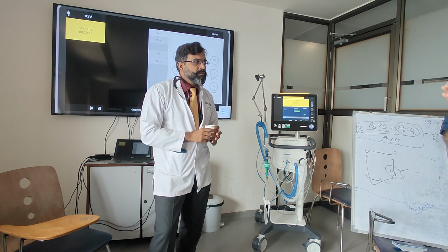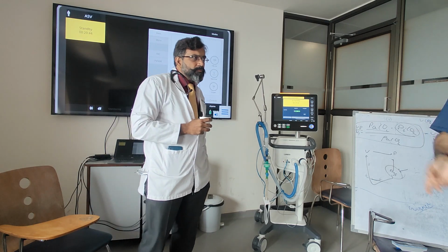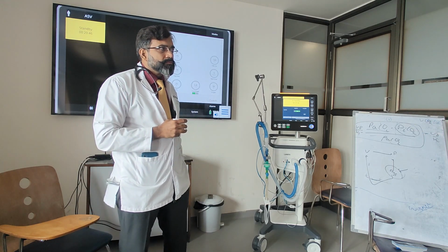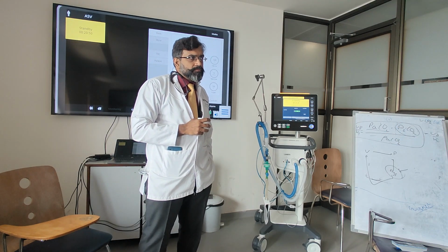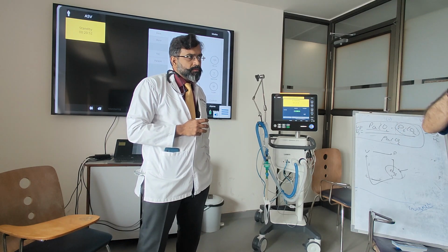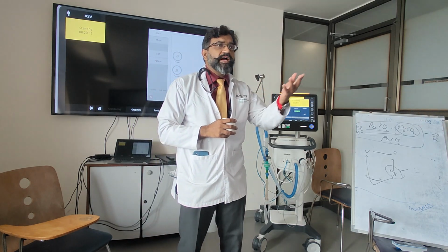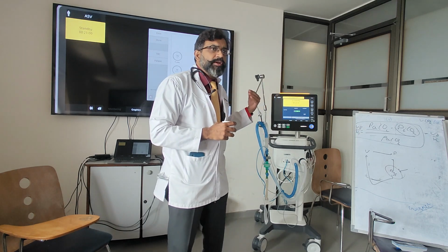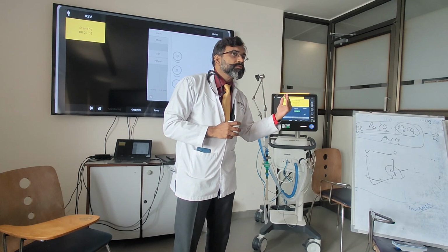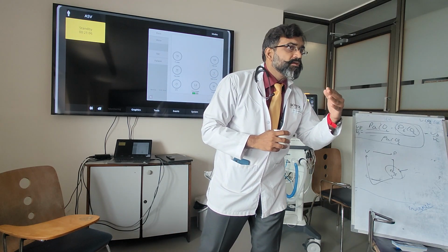I agree with what sir said, because we are going to start learning it again, we also have to start with a simple or normal patient so that we understand it better. Because when we start with a difficult patient and, as sir said, we get alarms and all, we will also be confused. For example, you take a patient who has had cardiac surgery and put him on ASV. Do you think there will be problems or no problems? Why problems? In cardiac surgery, there will be no problem.